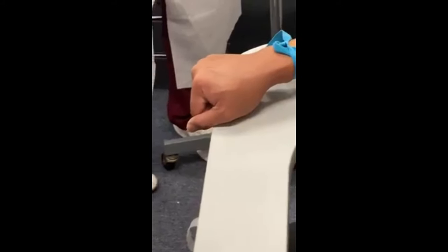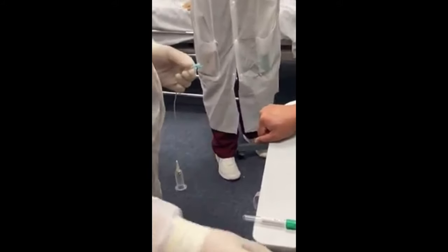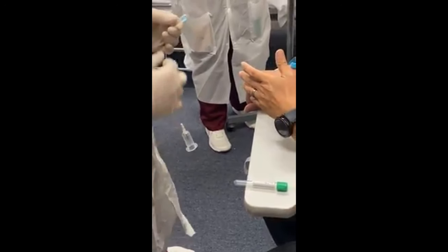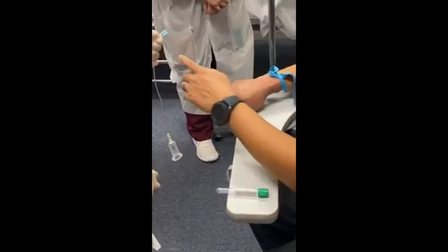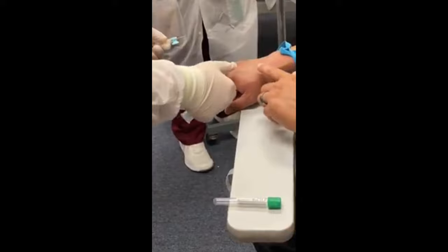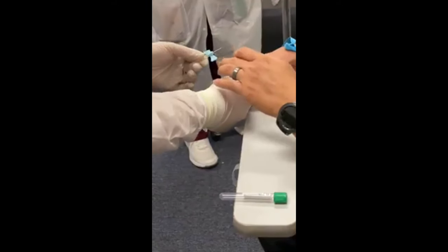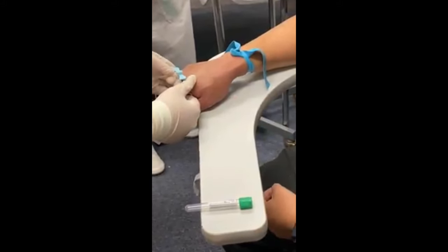So I'm going to uncap. For this one here, the placement, since it's the hand, it's kind of hard, not really hard, but you have limited area to rest your fingers. So just try your best, where you feel comfortable anchoring. At the same time, as you stick, anchor your fingers too. So yeah, like that, exactly.